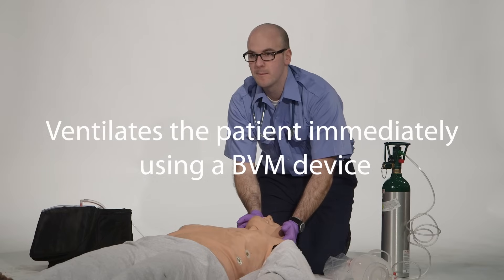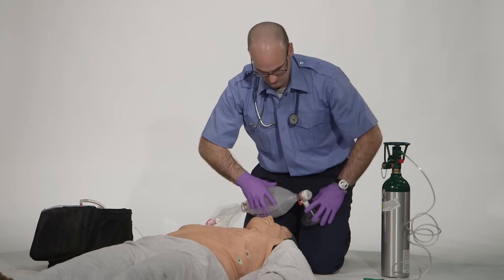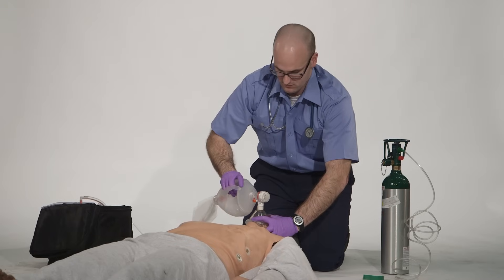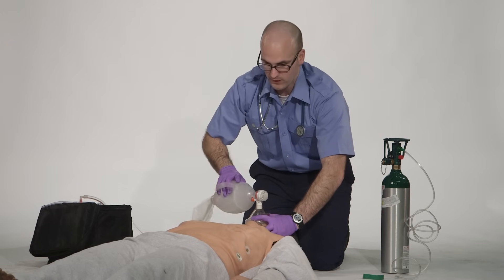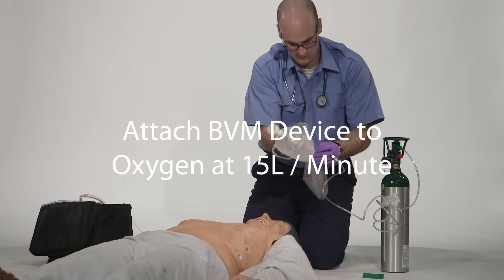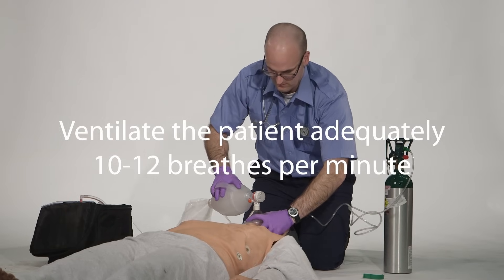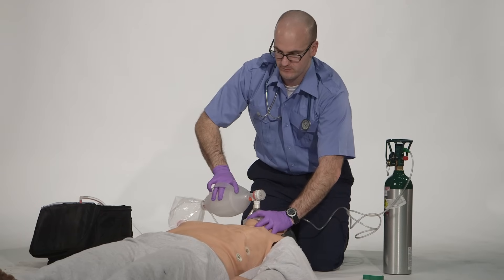Ventilate the patient immediately using a bag valve mask device without attaching the oxygen. Recheck the pulse for at least 5 seconds but no more than 10 seconds, then attach the BVM assembly including the mask, the bag, and the reservoir, and supply oxygen to at least 15 liters per minute. Ventilate the patient adequately, providing proper volume to make the chest rise at a rate of 10 to 12 breaths per minute, not to exceed 12 breaths per minute.